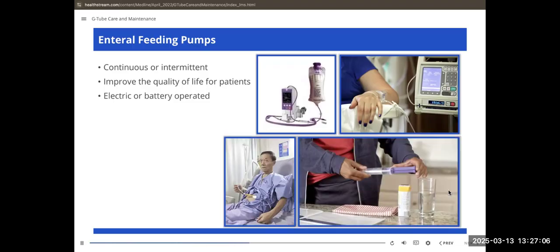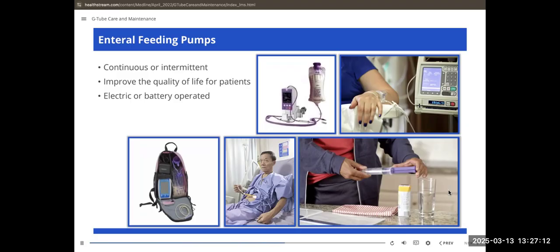Most recently, there has been an enteral pump for children and young adults, which is stored in a backpack, which maintains some privacy. Pumps typically come with a specific delivery bag, kit, or packaged product. They also may come with disposable sets and accessories that make it easy for patients to get the nutrition they need, whether they are in their homes, in hospitals, or on the go.